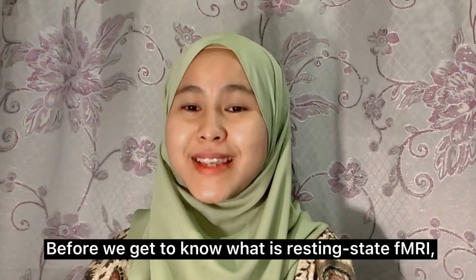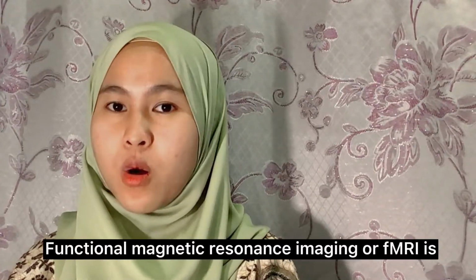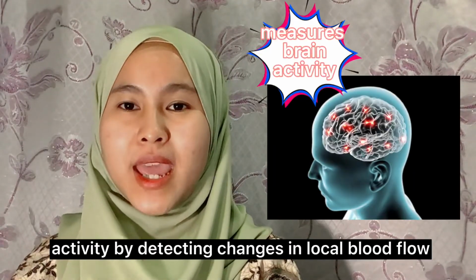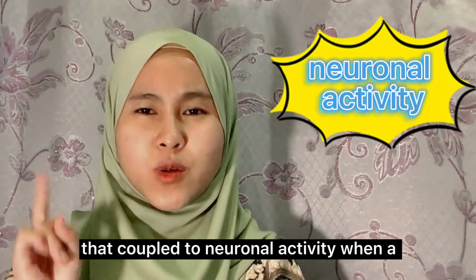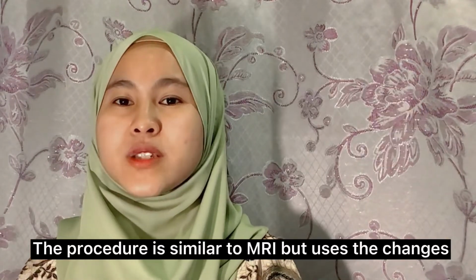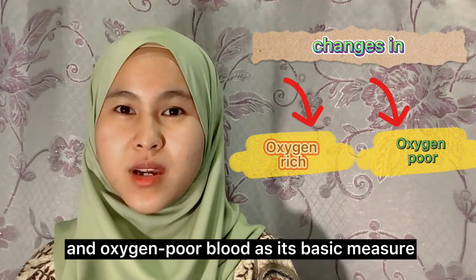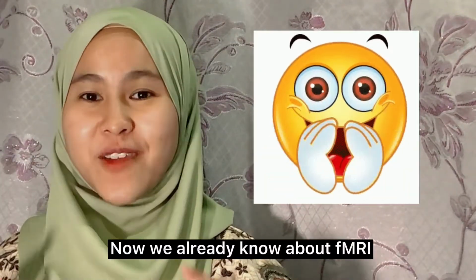Before we get to know what is resting state fMRI, let's get to know first what is fMRI. Functional magnetic resonance imaging, or fMRI, is an advanced MRI technique that measures brain activity by detecting changes in local blood flow that are coupled to neuronal activity when a specific task is performed. The procedure is similar to MRI, but uses the changes in magnetization between oxygen-rich and oxygen-poor blood as its basic measure.